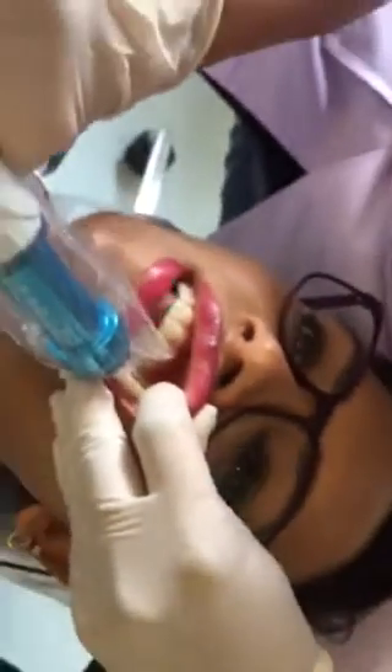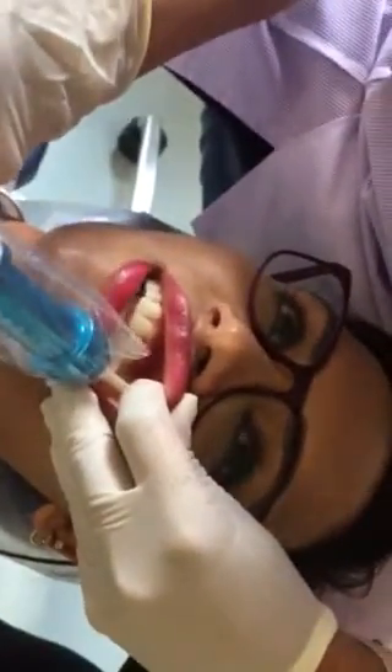Is my phone in your way? Can you see what you're doing? Yeah, I can see what I'm doing. Okay, the sulcus is where I'm going. So I press it down — just press it firmly. That was amazing! Did you feel anything?